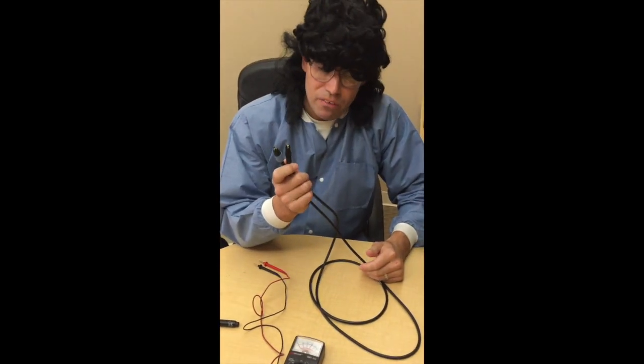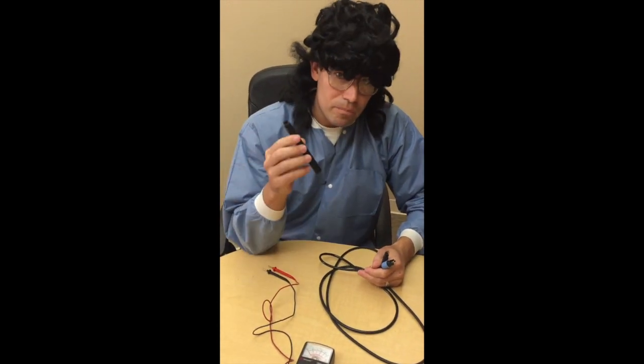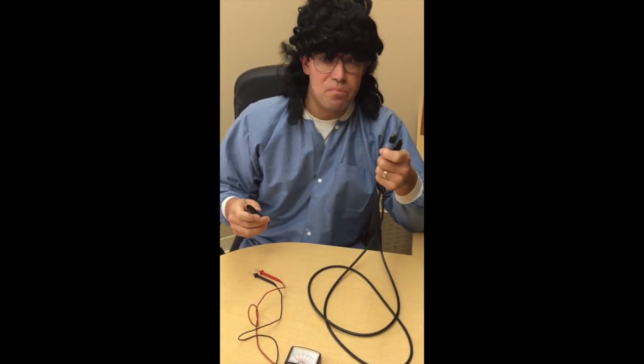Unfortunately, this is not a repairable device, and you have to replace the whole cable. It's unlikely to be the handpiece, but it is possible. But we know for sure the Cavitron doesn't work because this cable is bad.